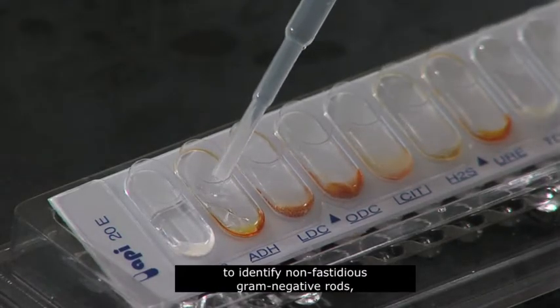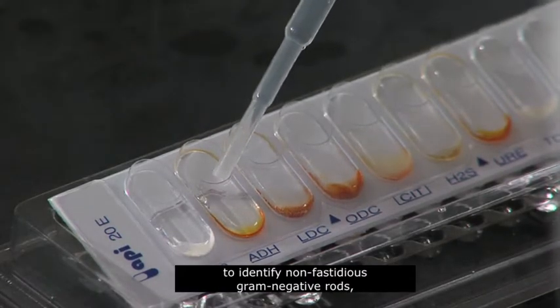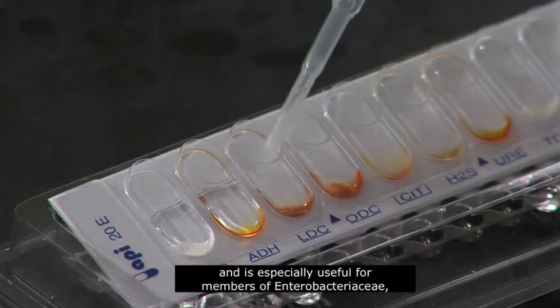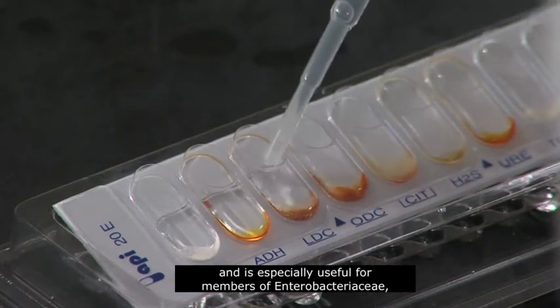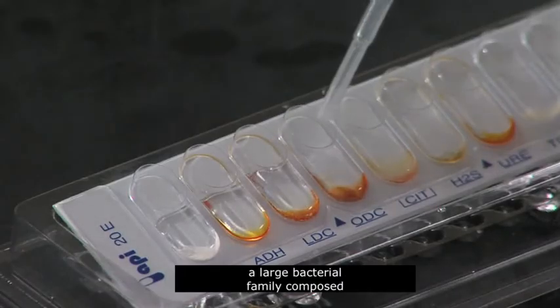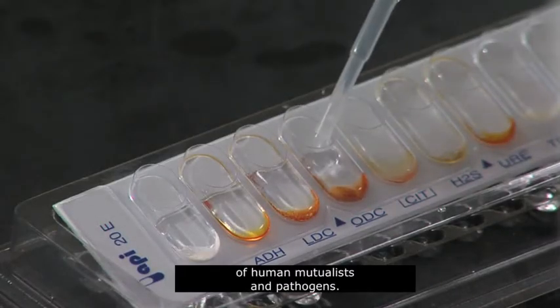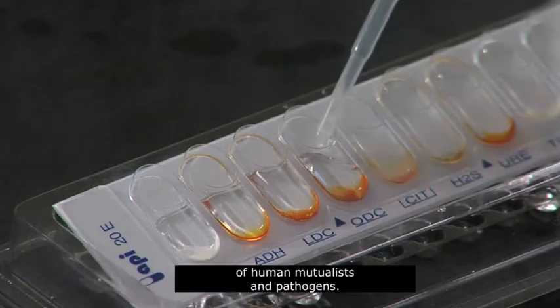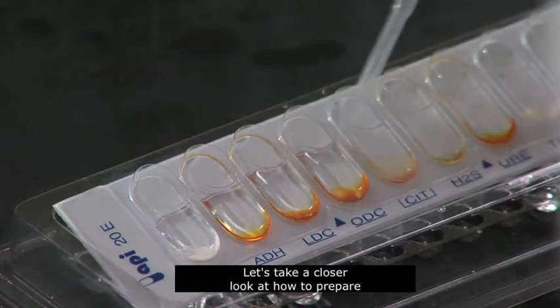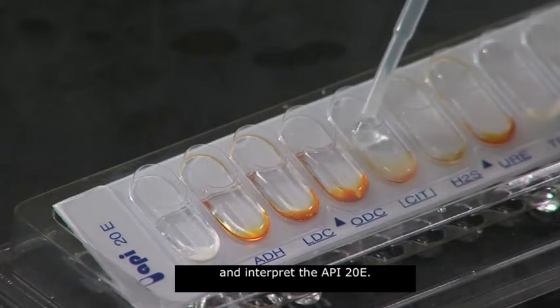This test is designed to identify non-fastidious gram-negative rods and is especially useful for members of Enterobacteriaceae, a large bacterial family composed of human mutualists and pathogens. Let's take a closer look at how to prepare and interpret the API-20E.